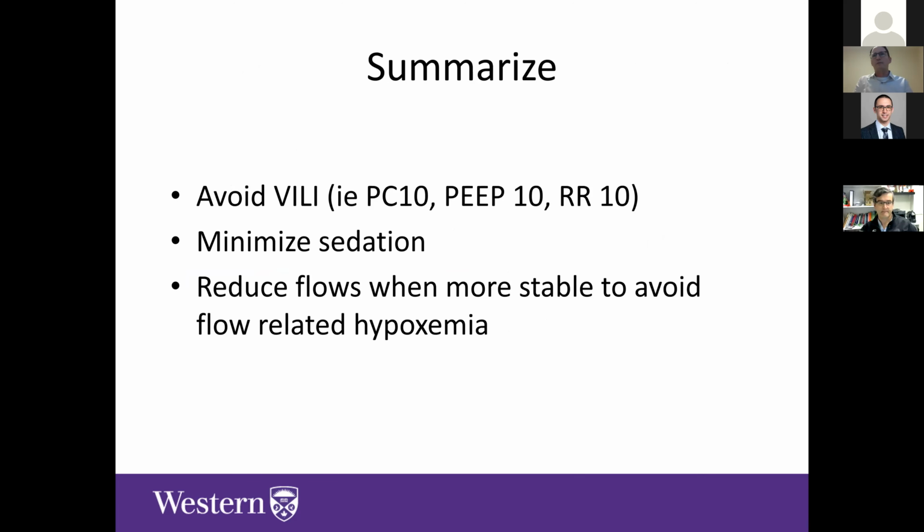So just to summarize, the main guiding principles in this, and it's a very complicated and challenging topic around the world to deal with, but the guiding principles are avoiding ventilator-induced lung injury, trying to minimize sedation if we can, recognizing that's not always easy to do, particularly in COVID patients. And then we want to reduce the flows when the patient's more stable, so that we can avoid flow-related hypoxemia.